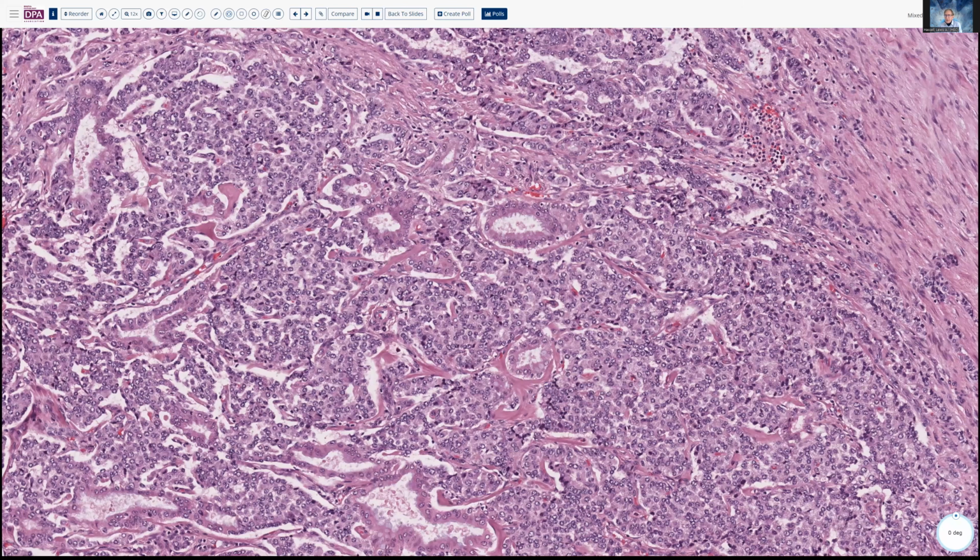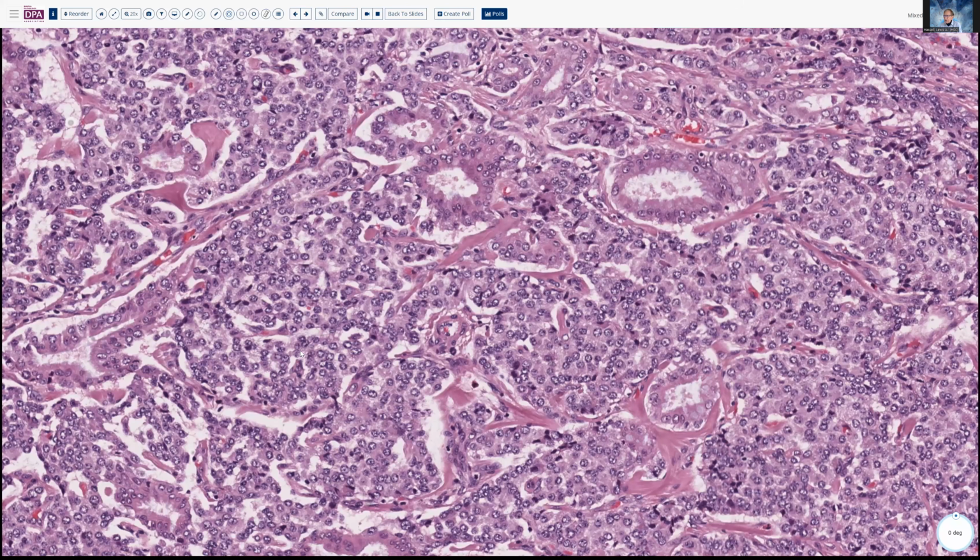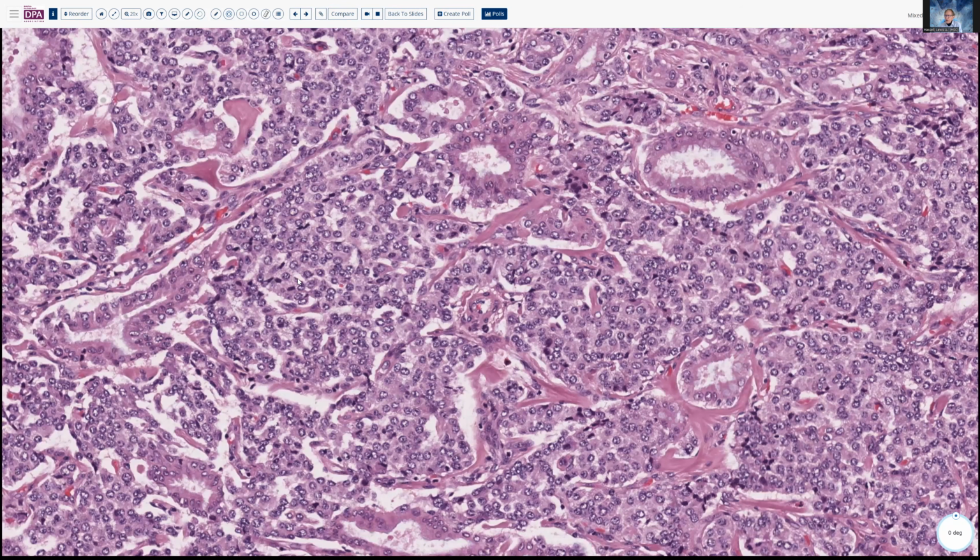Or are they part of the neoplasm? Are these a glandular differentiation from the neuroendocrine tumor? And as you can see, the bulk of this solid tumor has nicely granular cytoplasm, somewhat open chromatin with a little bit of salt and pepper and clock face type of appearance. And then a fairly similar nuclear appearance in these more ductal-like or ductal type of epithelial cells.